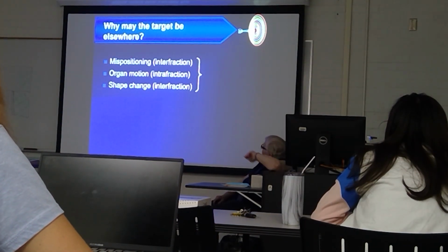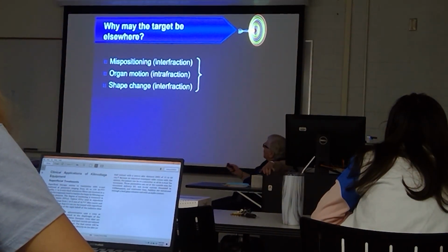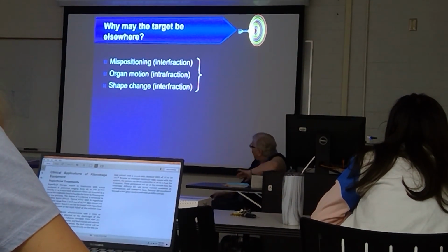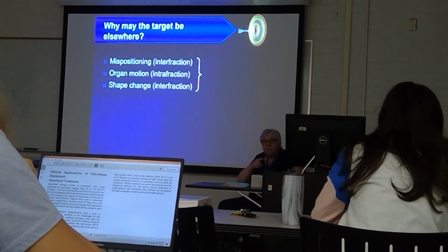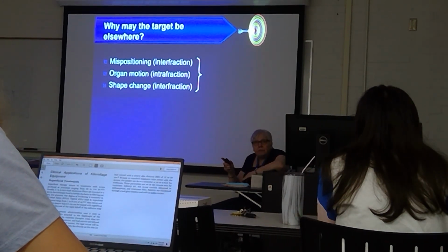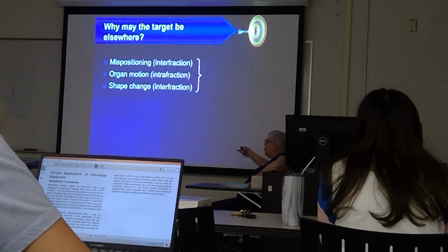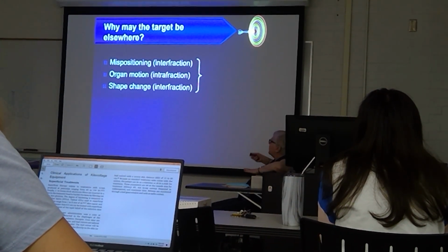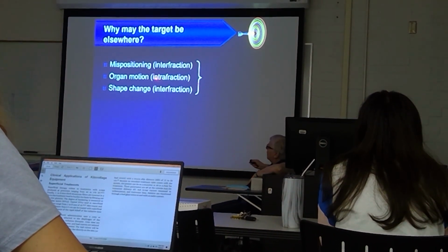So, why may the target be elsewhere? Mispositioning. So this is interfraction. Interfraction means in between the treatments, right? So you're treating them on Monday, and then you're treating them on Tuesday, and then on Wednesday, etc. So this would be interfraction.